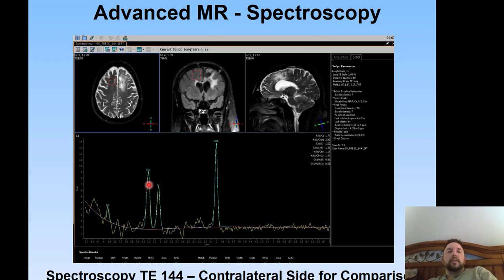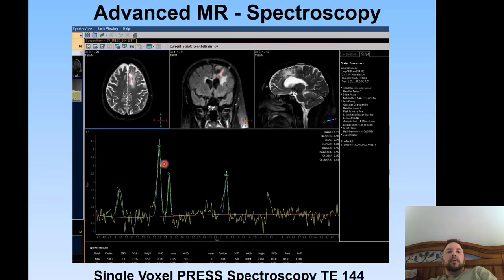I'm going to go back to the gentleman's area where the tumor is. Do you see the amount of choline is far greater than the amount of NAA? This is a perfect display or a perfect indication of what's known as a choline spike. So this is basically indicating for you that there's malignancy found in this particular region of interest. This is a reversal of the hunter's angle.